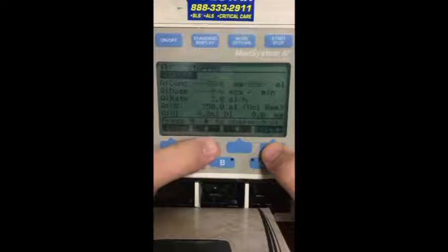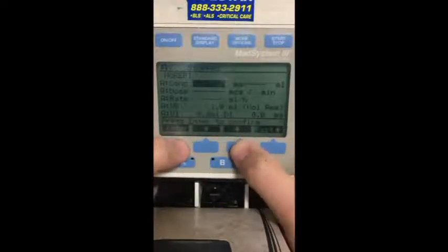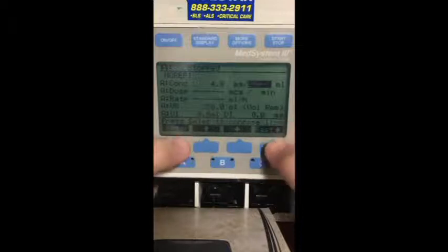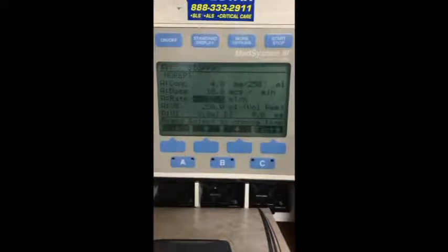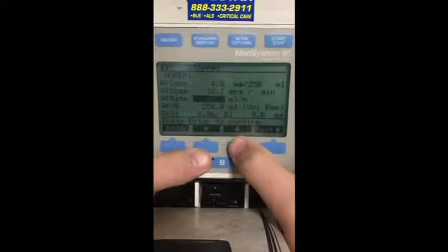So if we go up to norepinephrine, same thing, concentration, we're going to put 4 milligrams into a 250 milliliter bag, and our dose, we're going to start at 10 mics per minute. Depending on the patient, I've started at 5, I've started at 7.5. And once again, it automatically calculates our rate. So if we increase the rate, the dose increases.